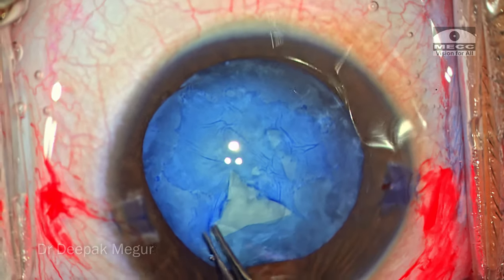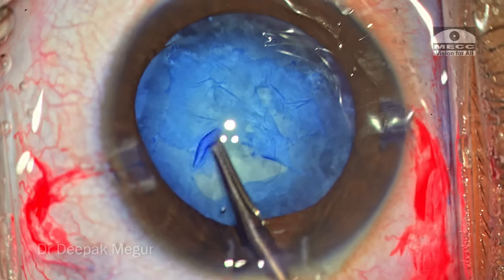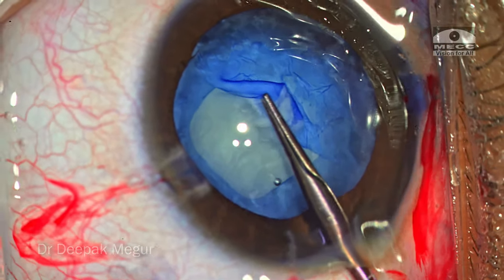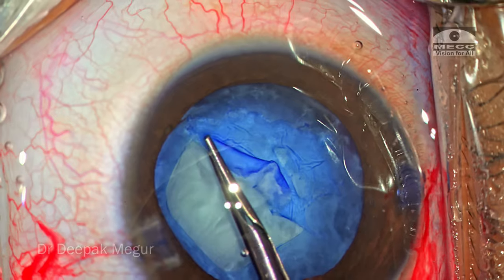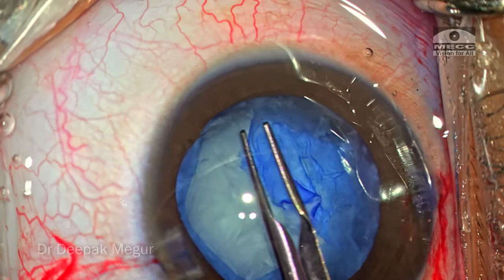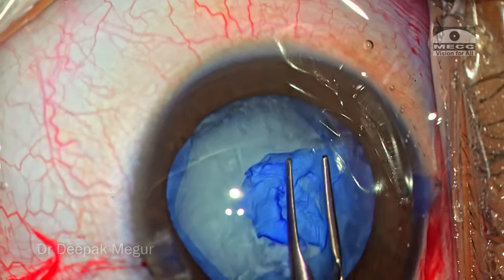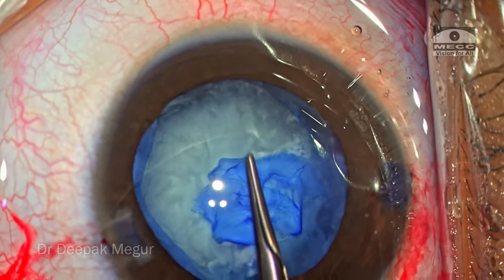I will be switching between a tearing and a shearing technique based upon how the capsule actually behaves. In the beginning I try to fold and tear it, and the moment I feel it is running away, I make the capsule flat and try to tear around the edge of the fibrotic zone. Remember, this is a 6-year-old child — the capsule is going to be extremely elastic. So as the rhexis is being performed, I keep the capsule flat and use the tearing technique more often than the shearing technique, because this reduces the chances of the rhexis extending beyond the equator and it's always easier to pull it back.